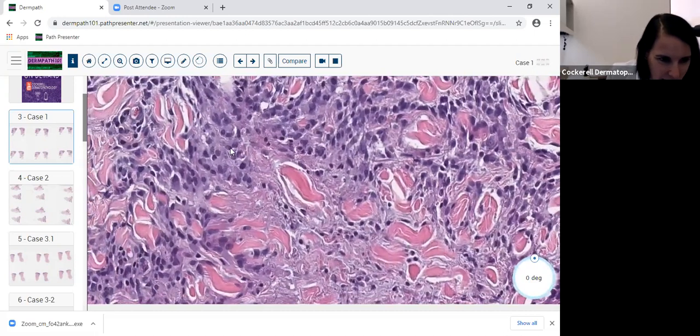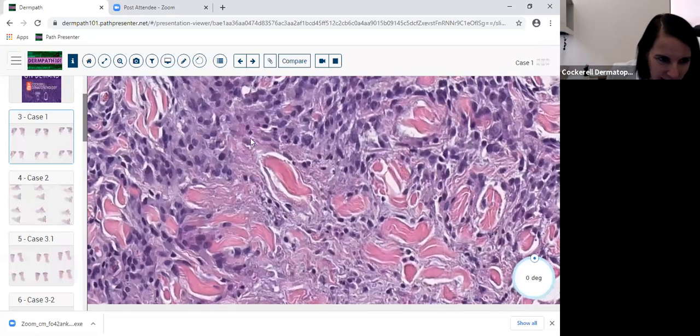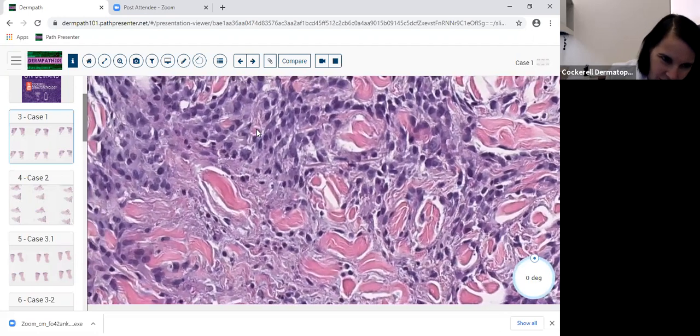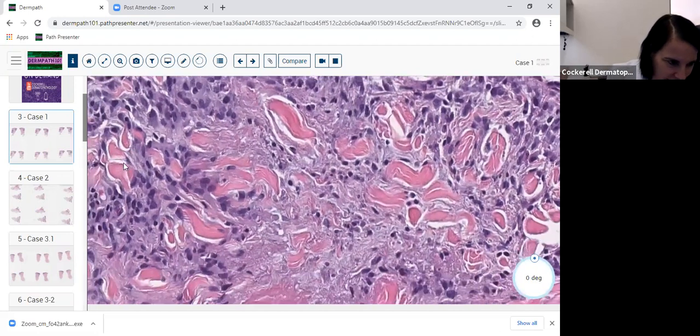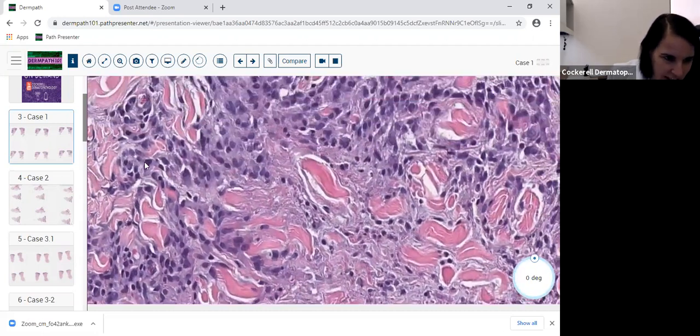And when you go on higher power, you right away recognize them as histiocytes, because they have very light, open chromatin with small nucleoli. And they have plenty of cytoplasm, although the cytoplasmic borders are not very well defined. So they're not really epithelioid, they're just plain histiocytes. And you'll see some lymphocytes around this. There are occasional lymphocytes. I don't see many eosinophils.